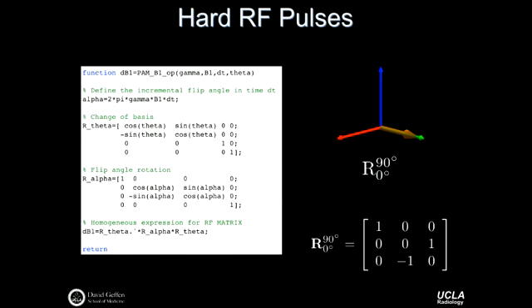If my thumb points along x like this, then the effect on this magnetic dipole, the bulk magnetization that was at equilibrium, is such that it's going to tip down and point along the y direction. I see a couple more nods. The second example is saying, let's not phase it about the x-axis, let's phase it about the y-axis. So I've rotated my B1 field to point along my y-axis, and now I tip over my bulk magnetization that was pointing straight up, and when I do that, it now points along minus x.